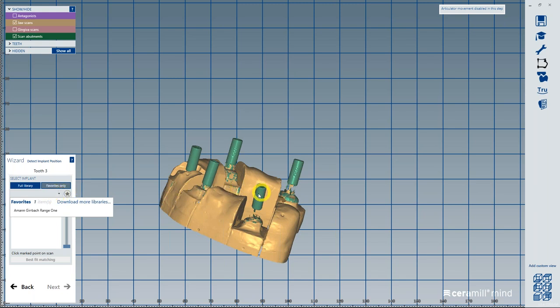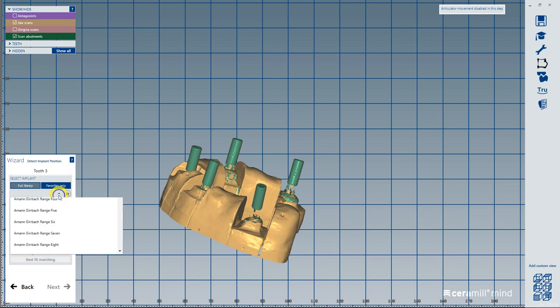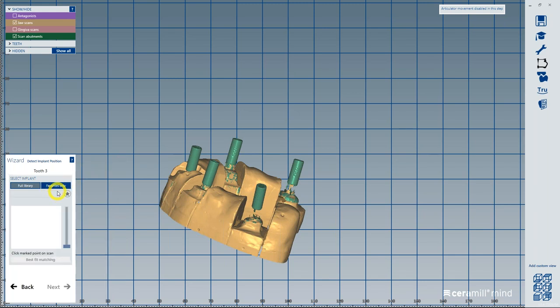So on tooth number three, I have it toggled on favorites. If you're using our system and you're used to this, I really like the favorites button because if I go to full library, I have a lot of different libraries, right? I got a couple gig of different implant libraries that I've added. You can download more libraries, but if you're using a certain one all the time, you can actually click it on and designate it as a favorite. So then when you go to favorites, that's the only one you have to cycle through and it's ready to go.